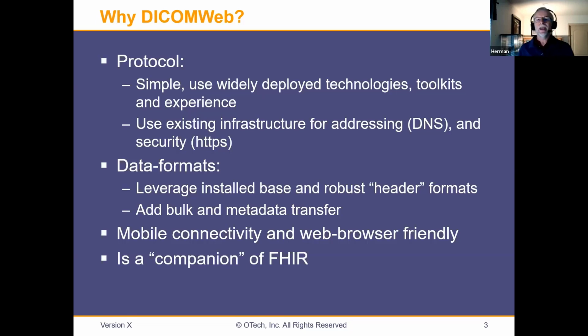The good news is that we actually refined the protocol a little bit. So now instead of downloading a 1.5 gigabyte file, we can say, let's take down only the header, or let's take only what we call the bulk data. So it's even better from a protocol perspective. We use the same old data format, and then we're able to split it up.